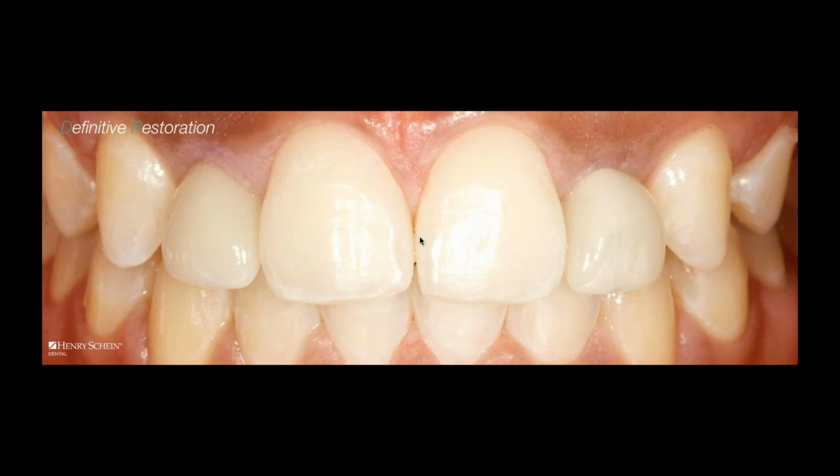Okay? We did not recreate nature. We did not recreate the illusion of nature. This is a therapeutic failure. Now, mind you, 2 perfectly integrated implants, 2 perfectly sound crowns, right? The color's fine. You know, we got good value, good aesthetics to the white, but the pink doesn't look good. The clinical crown length isn't good. Aesthetically, it is a compromise, and therefore it is, without a doubt, a therapeutic failure on day one.